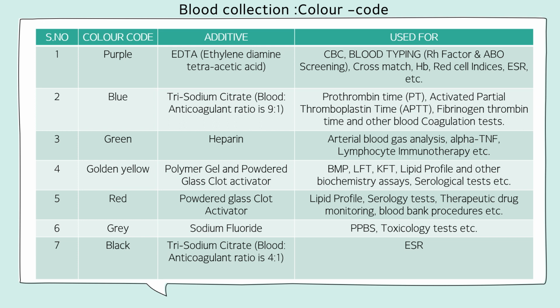Gray color cap indicates sodium fluoride, where we can perform PPBS, postprandial blood sugar, and toxicological tests, etc. Black color is again trisodium citrate, but with a ratio of 4:1. In this, we are able to perform ESR.